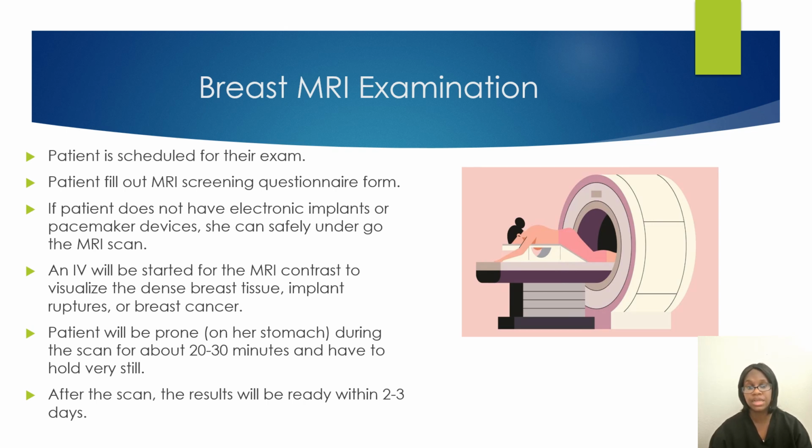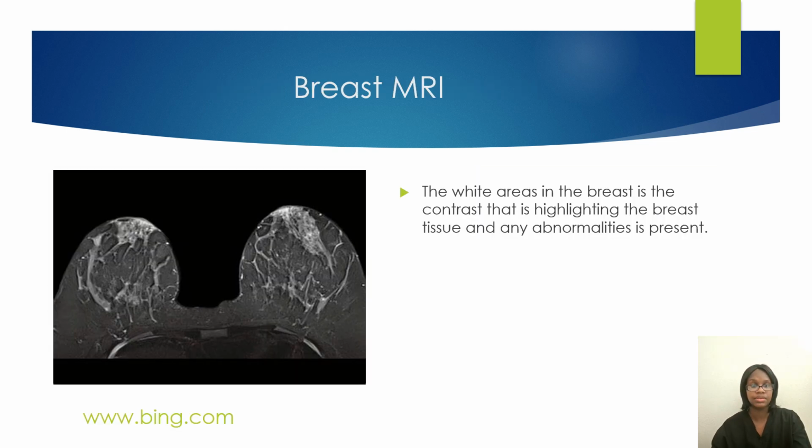They cannot have a stimulator or a pacemaker and just go in the room. If they do have a pacemaker or a stimulator, we have to do further research to see if it's safe for them to have the scan done, because not all pacemakers and not all stimulators are unsafe. Depending on the device and who made it, it can go inside the scan room if someone is operating it and turning it into MRI mode. This is an image of a breast MRI.